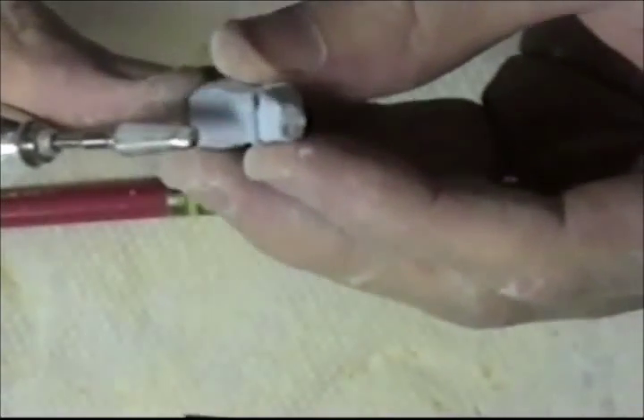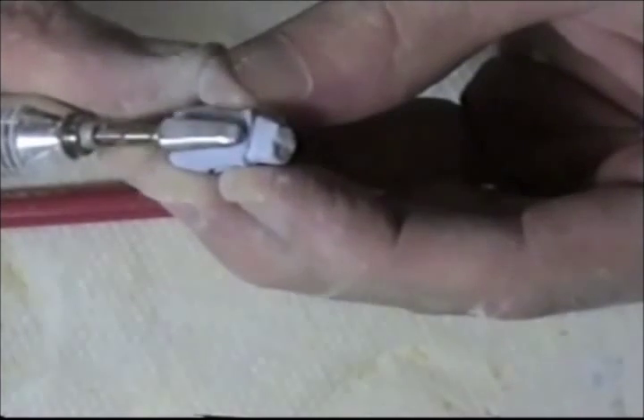Next, I use a pear-shaped burr in my handpiece to get even closer to the margins and continue removing any bulk.